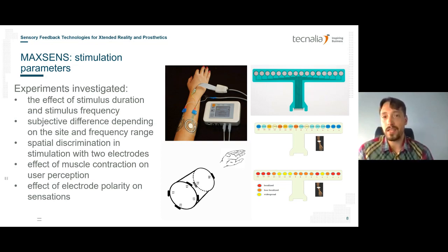However, intensity is also subject specific. Of course, an increase of intensity will be perceived as an increase for all subjects, but each subject will perceive it a little bit differently. We know that this is due to the physiological parameters of the skin, but also it's psychological. For some person, intensity is very high, when for some other it can be very low, when the sensation is more or less the same. So it's individual. In that sense, we wanted to exclude intensity from the modulation used for sending back the feedback, and to concentrate on the stimuli location and frequency.